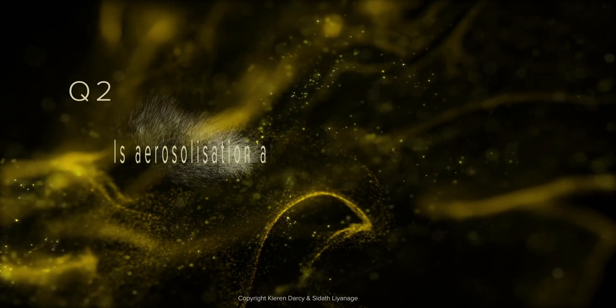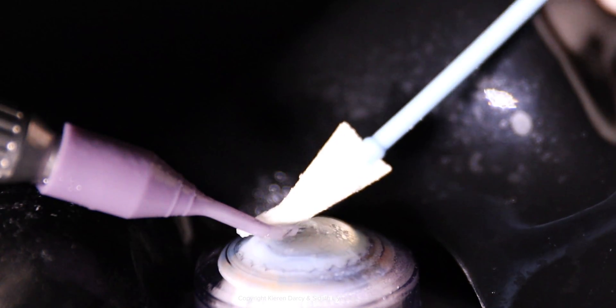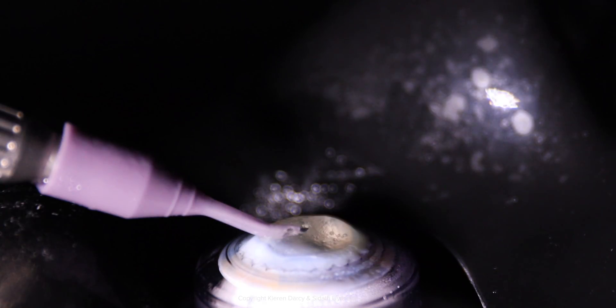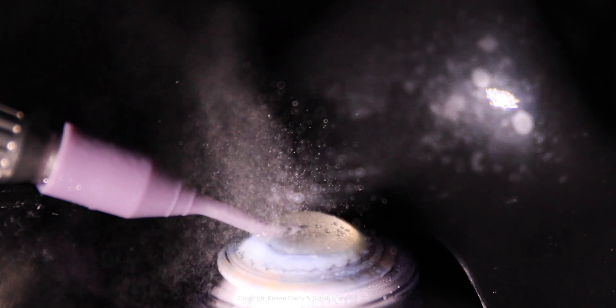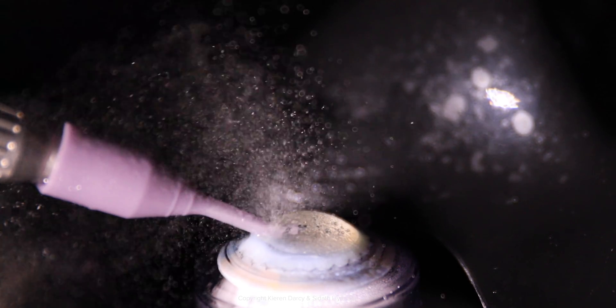Question 2: Is aerosolisation affected by corneal moisture? The cornea is dried with a spear. The aerosol starts immediately. The video evidence confirms the hypothesis. Aerosol originates from the anterior chamber.